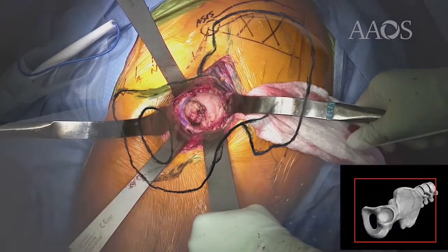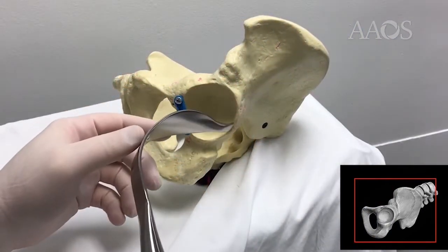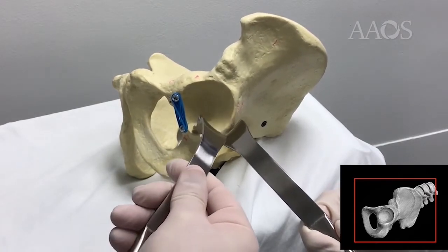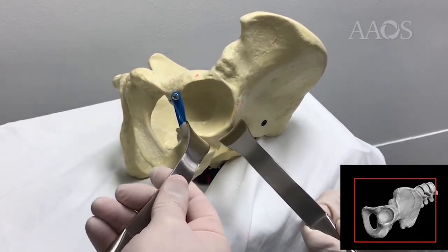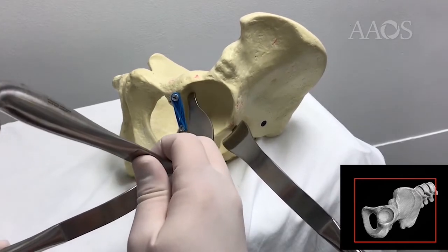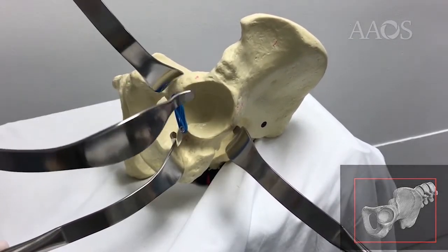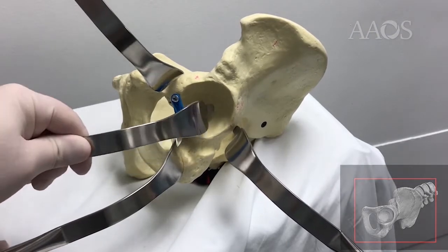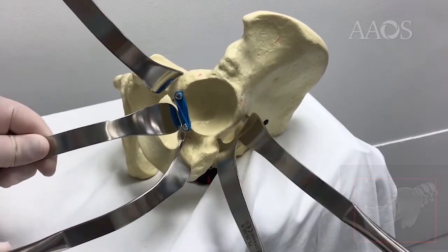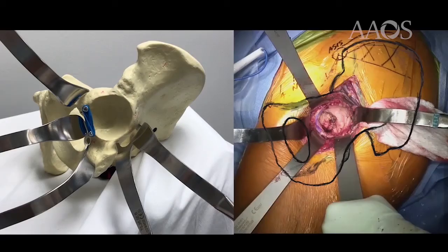As we transition to demonstrate this in a bony model, we begin with a lateral retractor, and our second retractor is of the posterior cotyloid. The next retractor is placed over the anterior cotyloid and the anterior brim of the pelvis, and if needed, sometimes we add this retractor here medially around the obturator foramen, deep to the TAL to protect and preserve it.